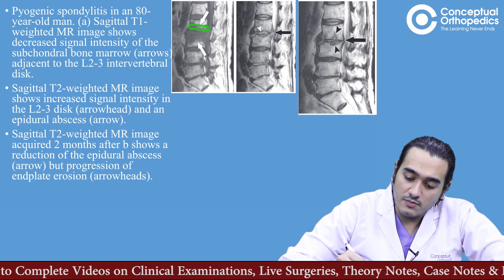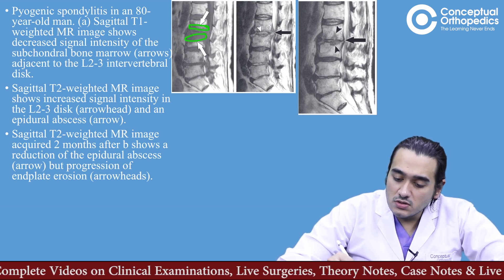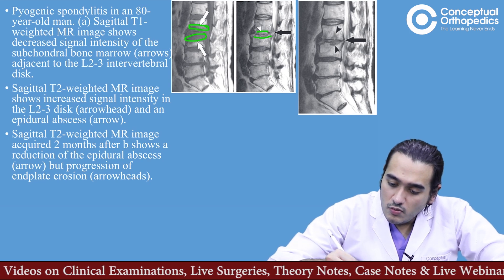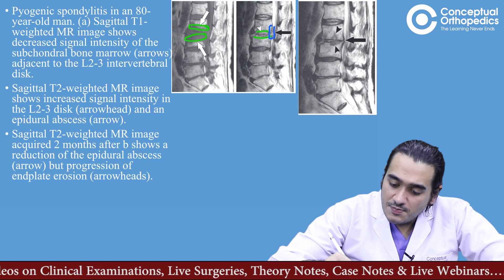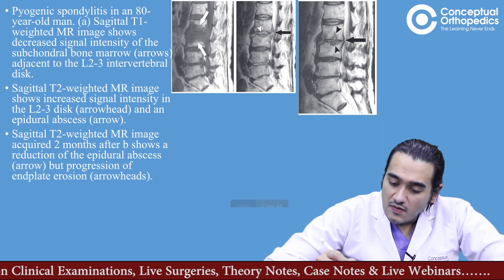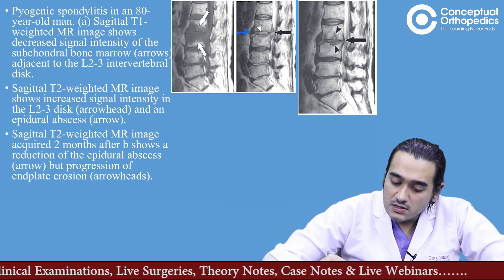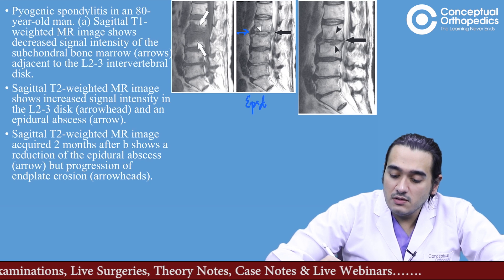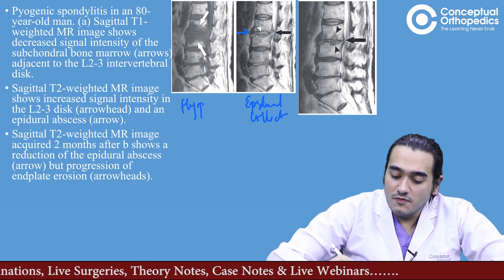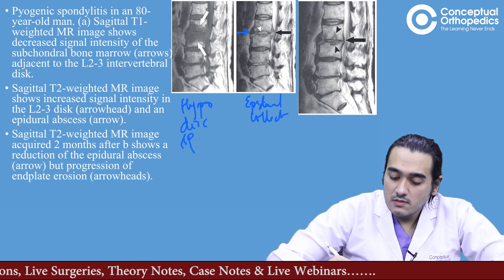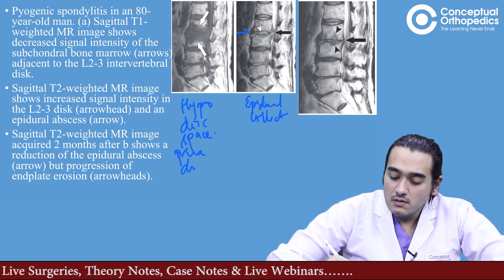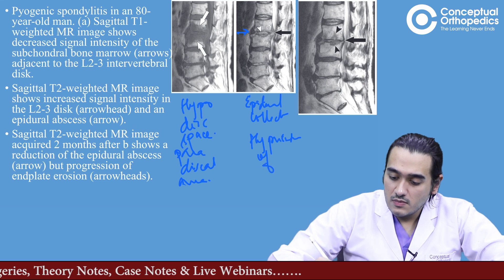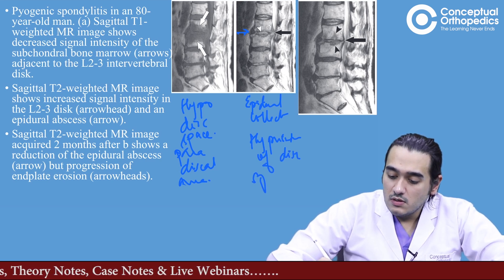When we look at the T2 image, it shows some amount of end plate changes. If you look closely, there is an epidural collection. One other important thing: if you compare this affected disc space with others, it looks hyperintense — more white. So whenever you have a picture showing epidural collection with hypointensity of the paradiscal area along with hyperintensity of the disc space on T2, this is an indicator that we are dealing with infection.